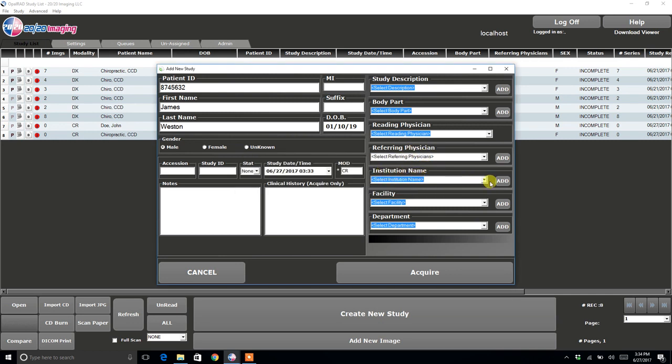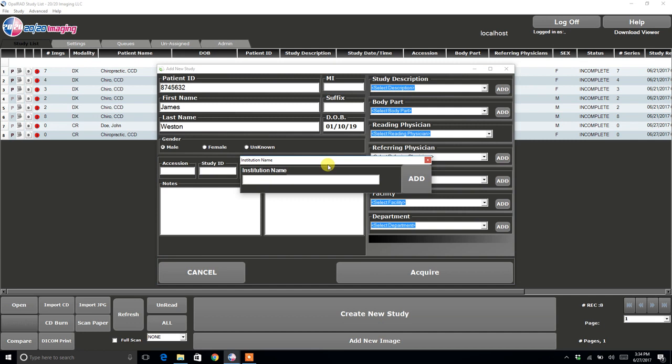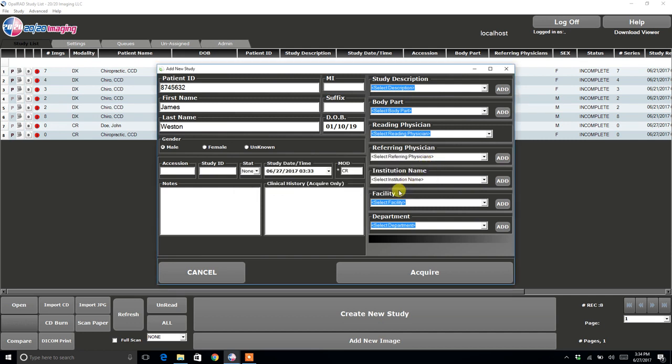Same with Institution Name. You will want to click Add and fill out the name of your clinic, and then click Add again. That will add it to the list.